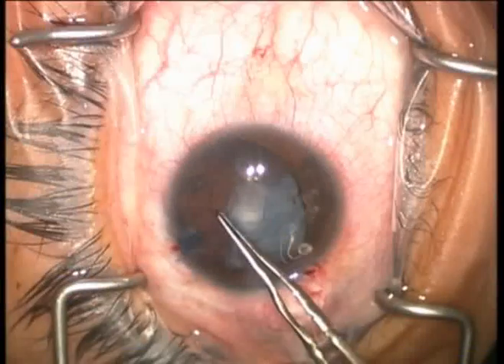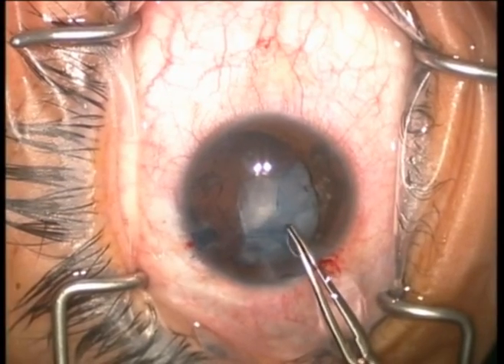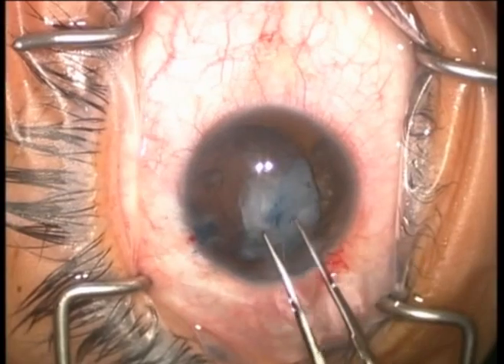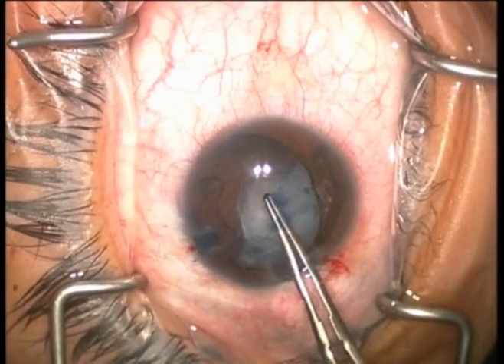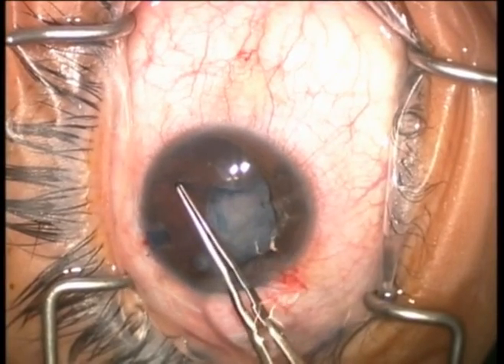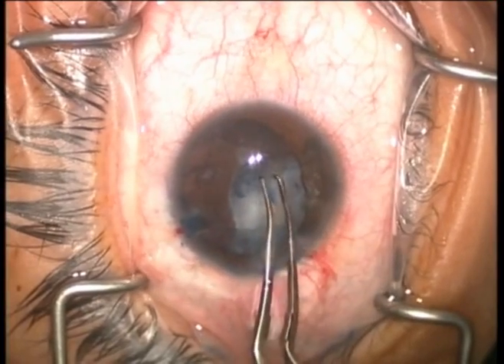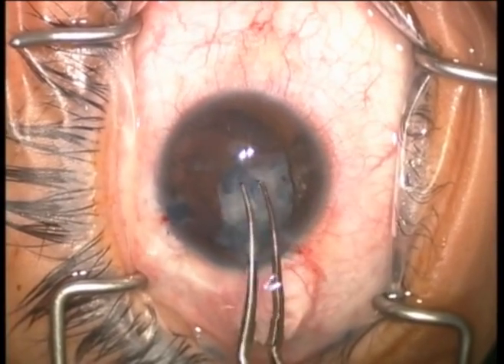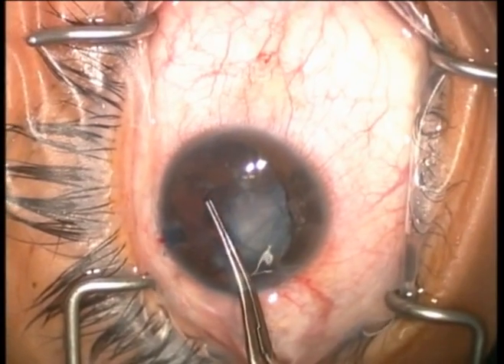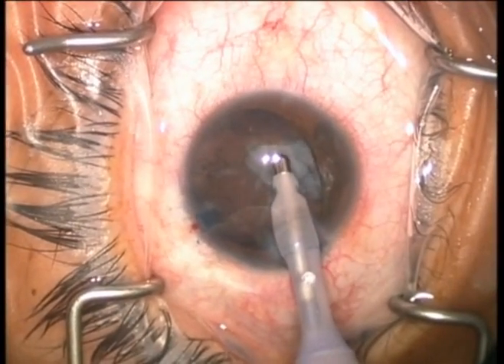Using this technique, we avoid that dreaded Argentinian flag sign, which is what happens when we use a sharp instrument like a sistatome to puncture the anterior lens capsule when the lens bag is filled with primarily liquid. The instability of the lens bag leads to a large rip of the anterior lens capsule, usually all the way out to the equator. By performing this technique with the FACO probe, we have a nice, round opening at the beginning to stabilize things.